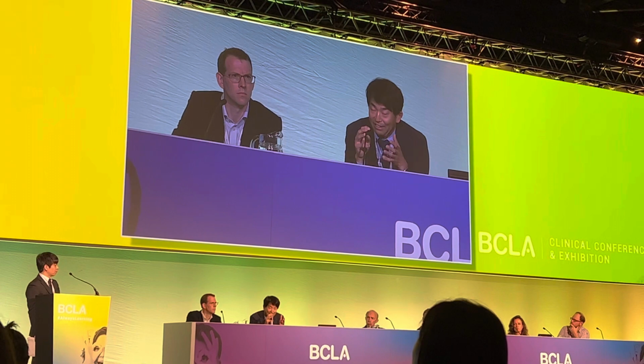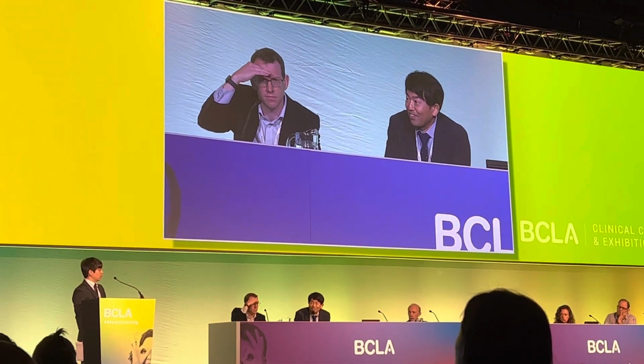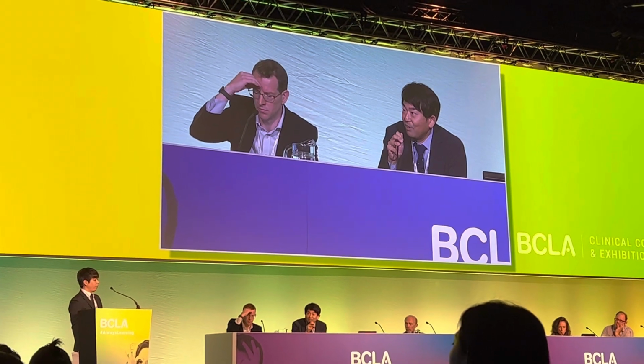As you know, the exact refractive power of these lenses is quite different. Same labeled refractive power, but maybe 0.2 or 0.3 is different.